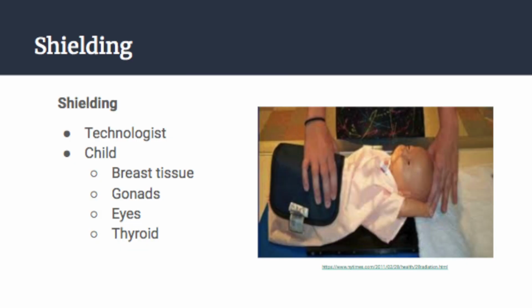Another thing to consider when thinking about immobilization tools and how to properly shield is having a caregiver or assisting technologist in the examination room with a lead apron. Oftentimes, a tech or parent must stay in the room with a lead apron on in order to hold the patient still or get their attention. To reduce their radiation level and to remain safe, they must wear a lead shield.